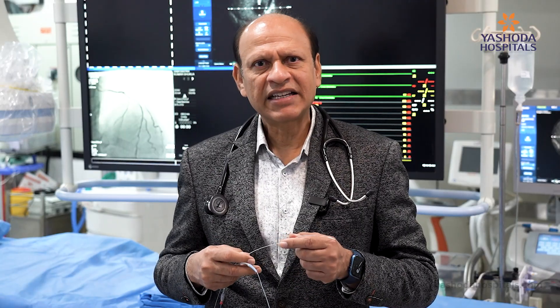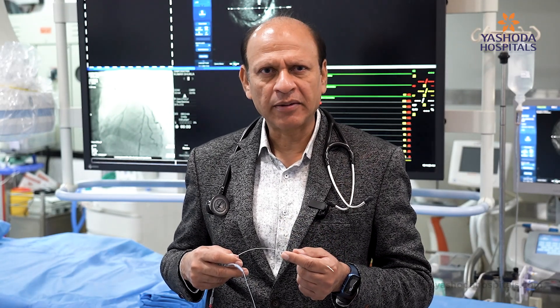This is the IVUS catheter, which is a three French catheter that is introduced over a guide wire while doing an angiogram to evaluate the coronary artery in much more detail than what is seen by an angiogram.